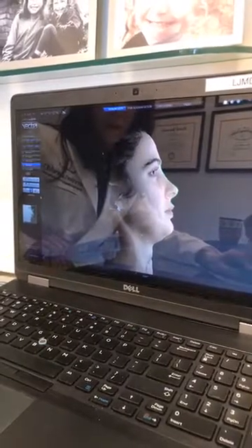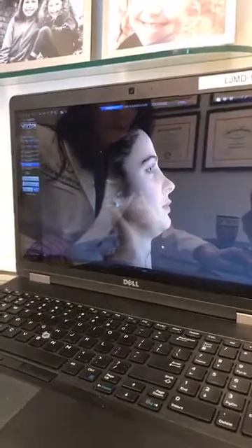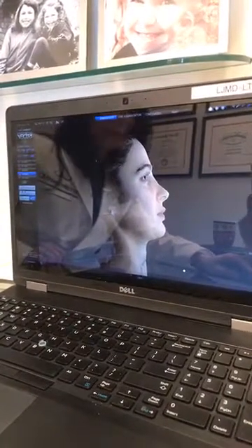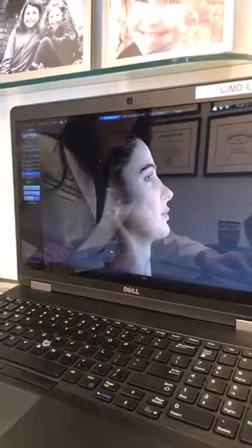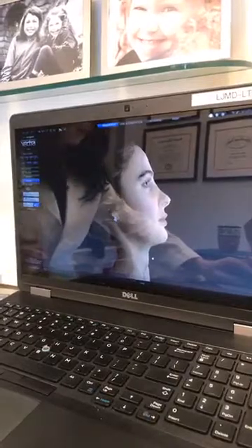And then another thing that has bothered Kristen is this area over here, which is her submental area, and we can take that up just like that, just to give you an idea, because most of the time, if you're going to be doing rhinoplasty, you might need some other procedures.